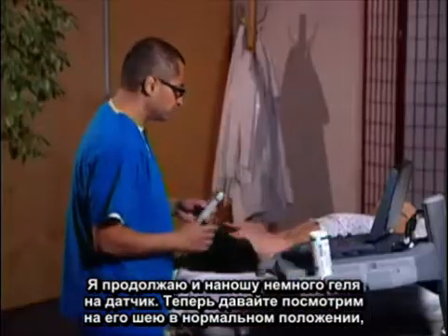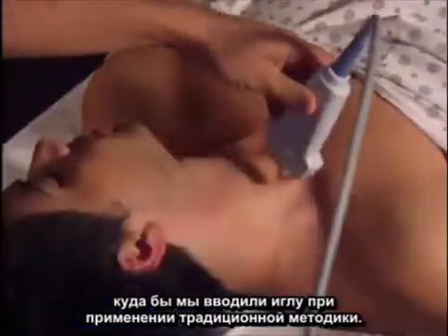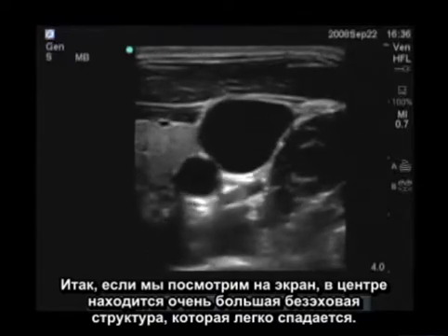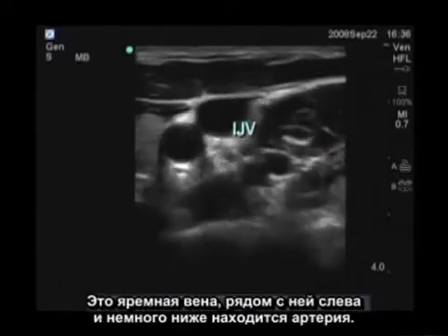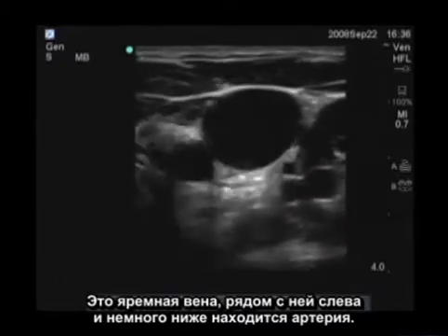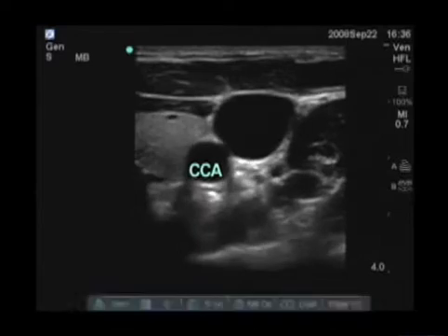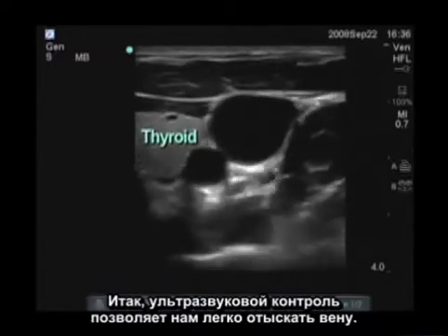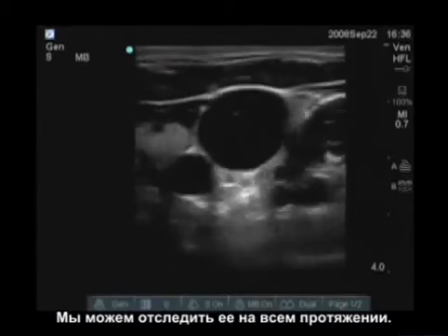I'm going to put a little bit of gel on the transducer and take a look at his neck in the normal area where we would place our needle. Looking at the screen, in the center is a very large anechoic structure that easily collapses — this is the jugular vein. Just adjacent to it, to the left of the screen and below the vein, is the artery, which is what we want to avoid. A little further to the left is the thyroid. Ultrasound allows us to easily find the vein and track it along its entire course.